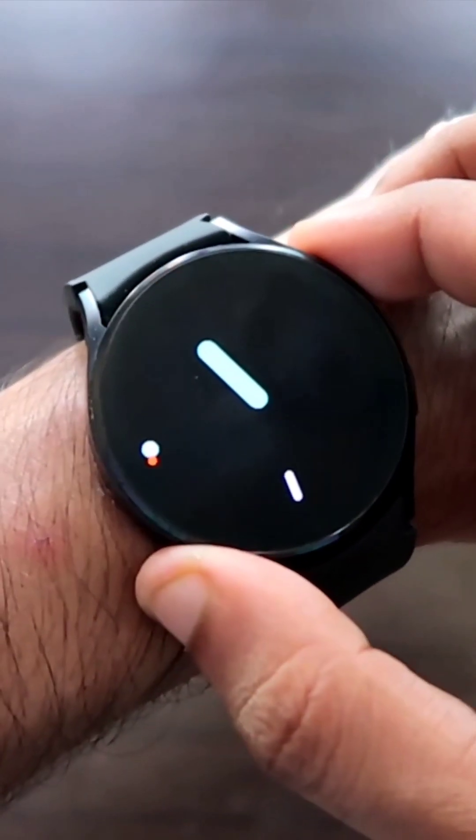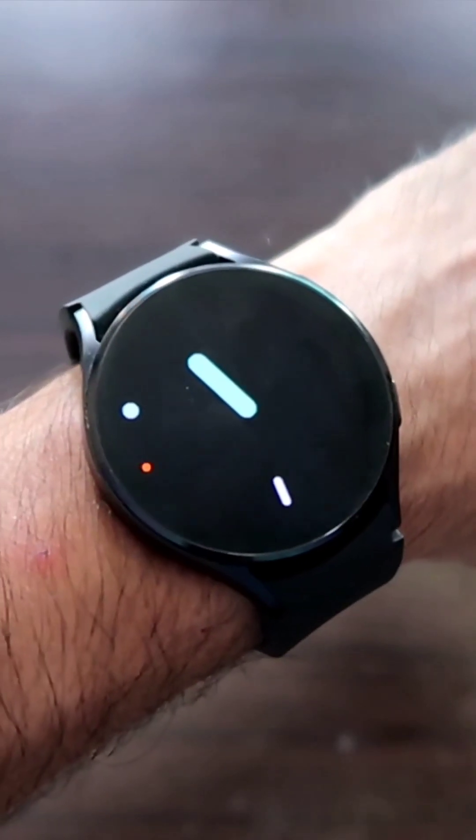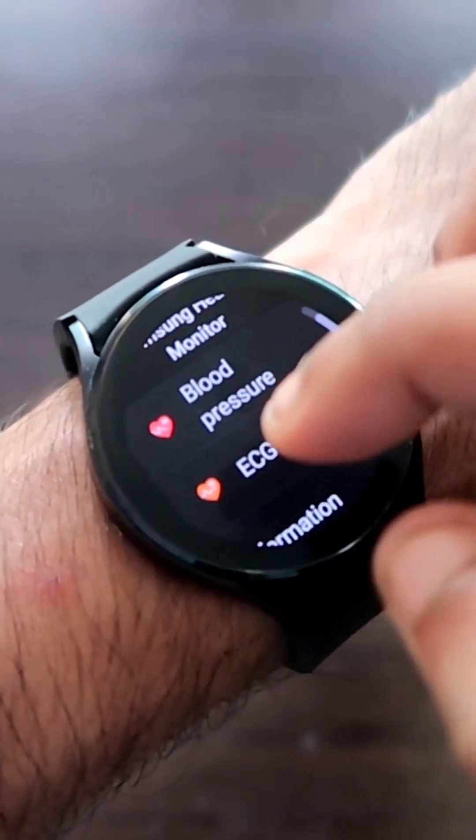ECG stands for electrocardiogram, and now you can measure your ECG via the Samsung Galaxy Watch 4. To do this, I have to go to this app, and here I will get the option to measure the ECG.